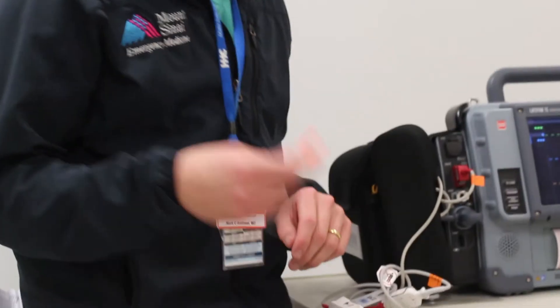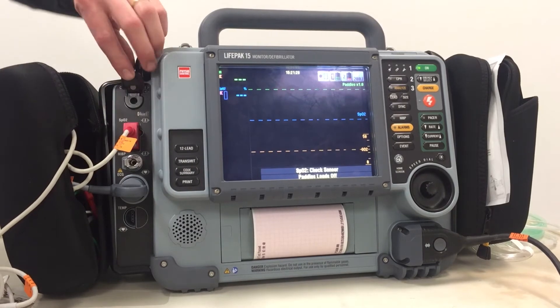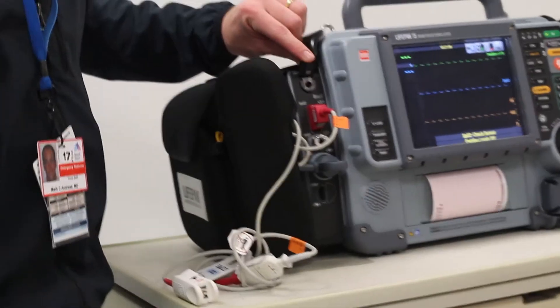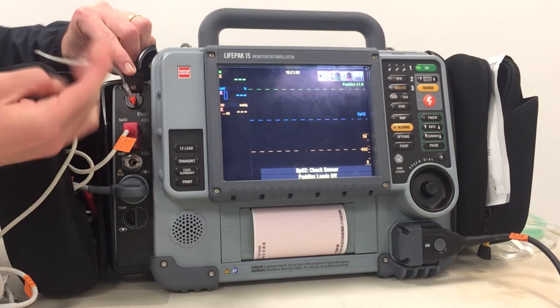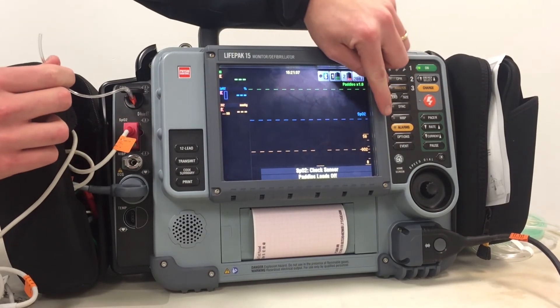We're also able to monitor end-tidal CO2 in line with the ET tube. In the upper right here, you screw in the orange port, give it a half turn clockwise, and the trace is going to come up immediately.